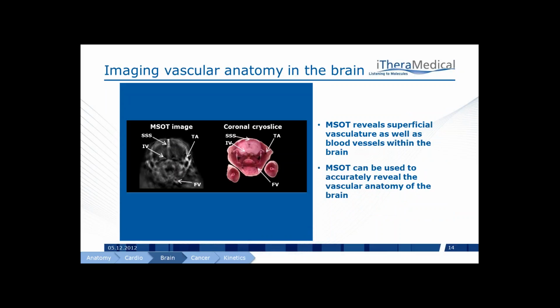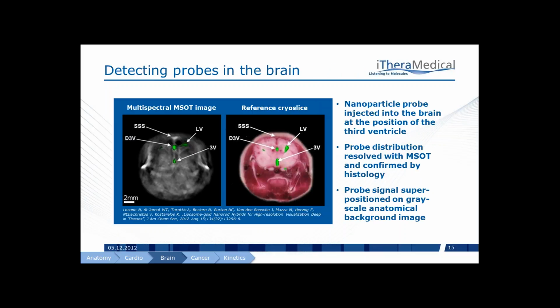Moving on to our next section, we've also done some studies looking at the performance of MSOT in the context of mouse brain imaging. In this case, again, we're showing a cross-section at the level of the mouse's brain, where we can see, again, through intact skin and skull, prominent vessels at depth without the need for any invasive procedures.